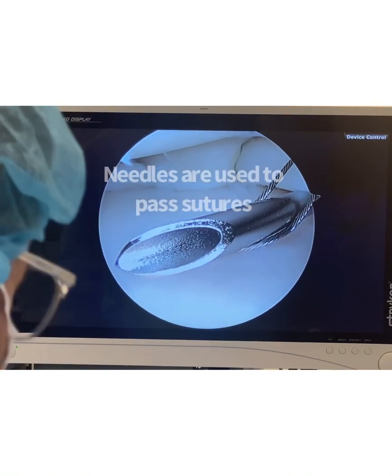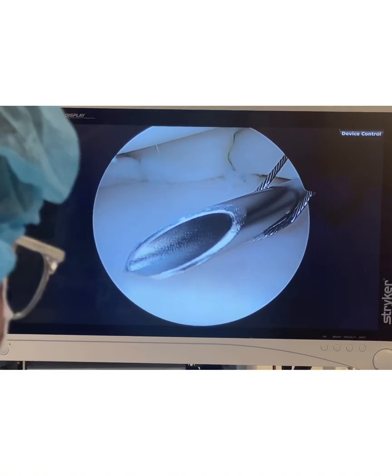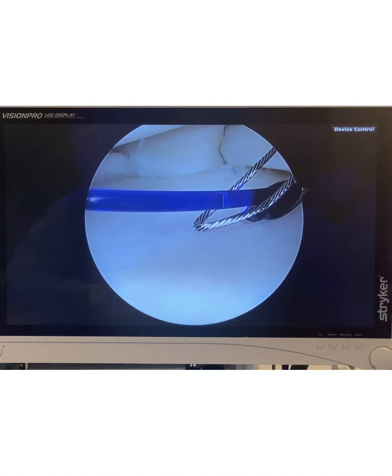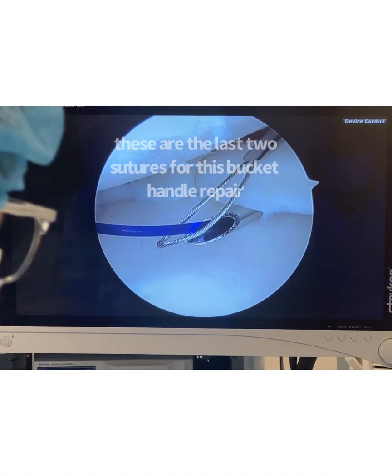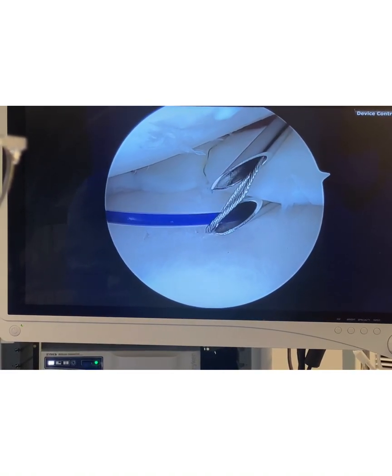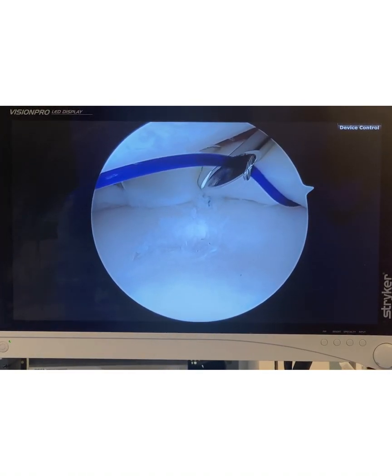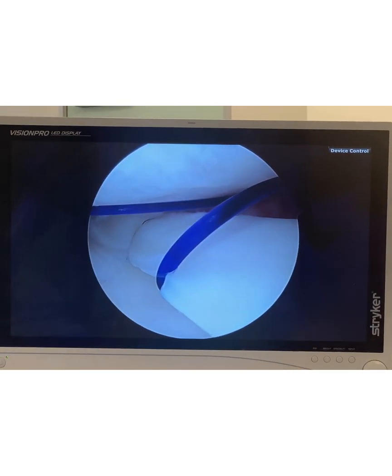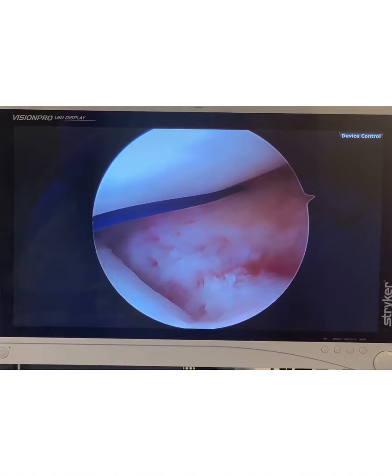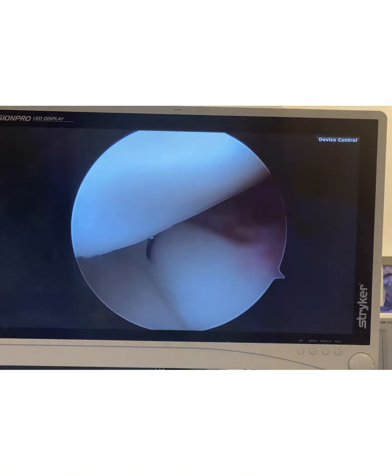This nasty bucket handle tear — so I slide in two needles, one above and one below. One needle has a metal wire-like loop; the other needle is fed a blue suture. The blue suture will be left in the loop, then the loop will be closed up and it's going to capture the blue suture. The inferior needle is removed so it doesn't cause any damage, and then the loop is pulled out. What's going to happen is that blue loop is going to be replaced with a more permanent suture.